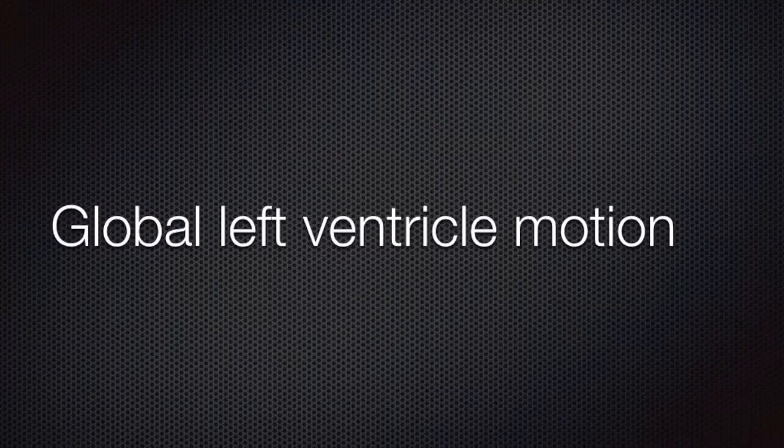Okay, so now let's look at global left ventricle motion. We might have read formal echo reports on patients we've seen on the wards who have poor left ventricular function, with things often quoted such as ejection fraction, which is normally about 60% or more. That can be complicated to measure in real life. However, we wouldn't expect you to do that, but we'd expect you to be able to see that things aren't quite right, because we've seen enough normal images now.